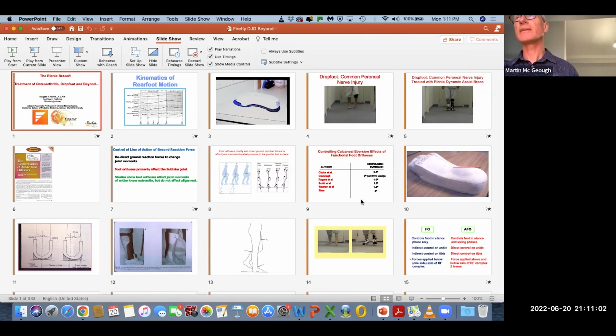And of course, the key thing is that the foot plate is an intrinsically balanced, custom-made foot orthosis. And again, they're not familiar with that because most of the solid AFOs they're seeing just simply don't have that, or they have a small little arch support, but they have no intrinsic cast corrections to control and alter that frontal plane and transverse plane. Yeah. Right.